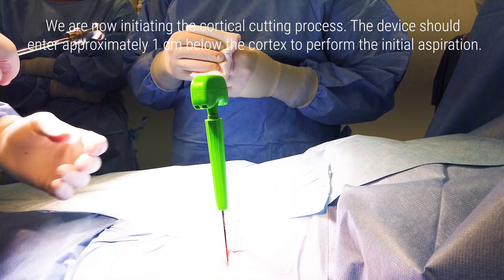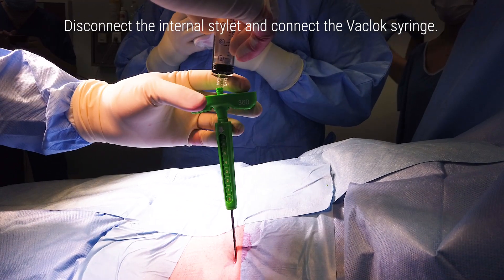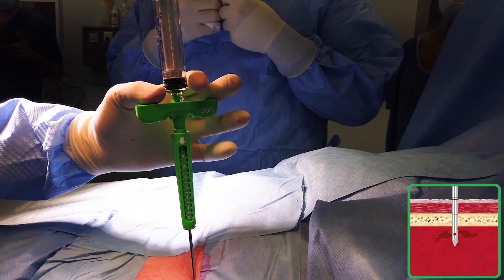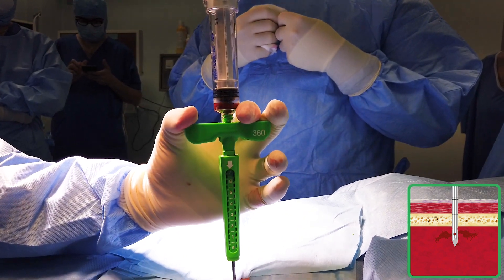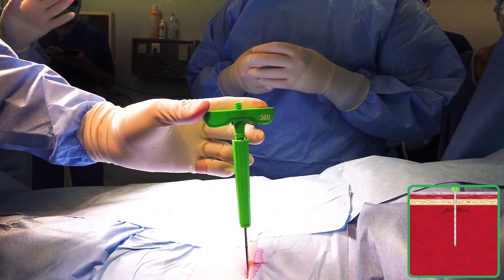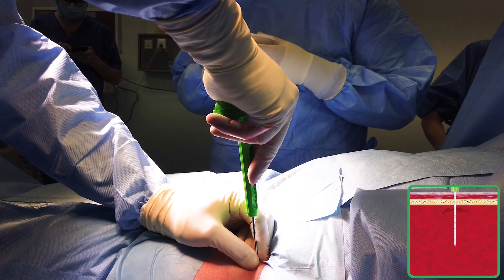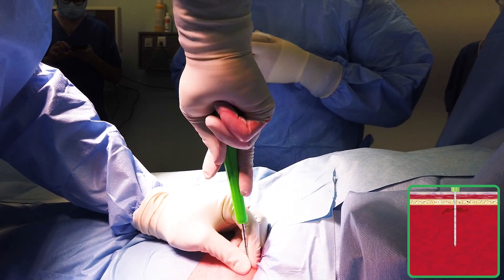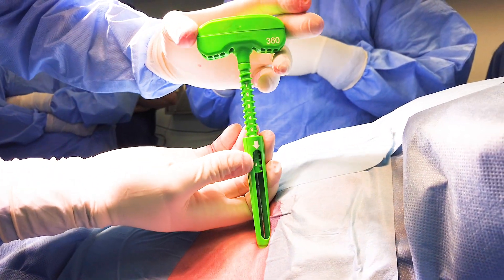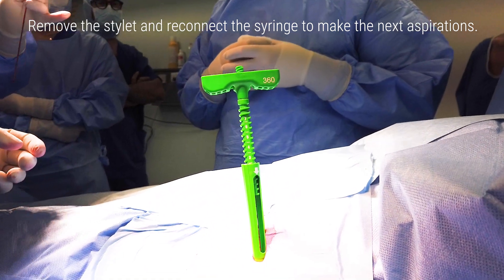We are now initiating the cortical cutting process. The device should enter approximately 1 cm below the cortex to perform the initial aspiration. Disconnect the internal stylet and connect the vac-lock syringe. Perform the first aspiration just below the cortex. After the first aspiration, reinsert the stylet and go down further, up to the desired depth. Turn the gear until contact with the skin and check the number below the arrow to know the remaining excursion. Remove the stylet and reconnect the syringe to make the next aspirations.